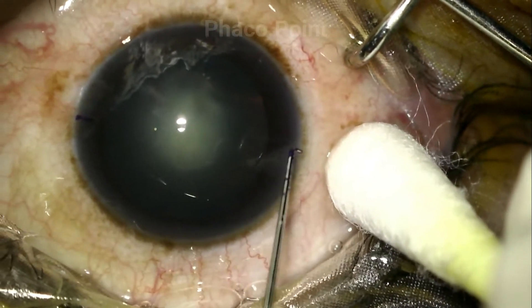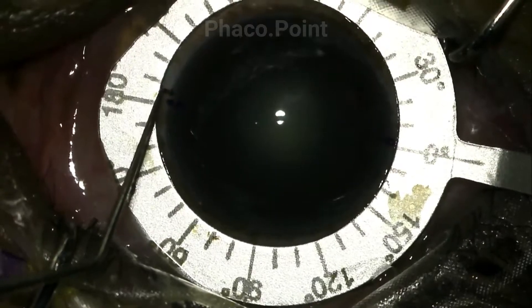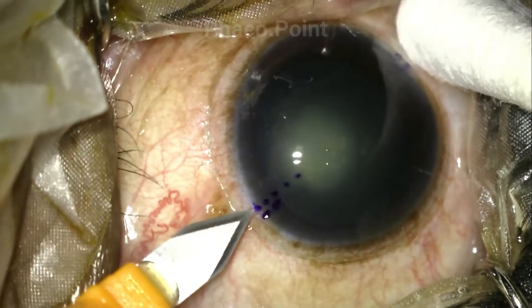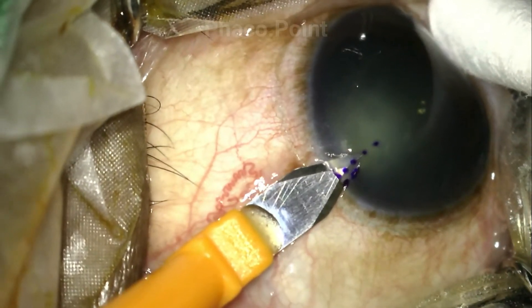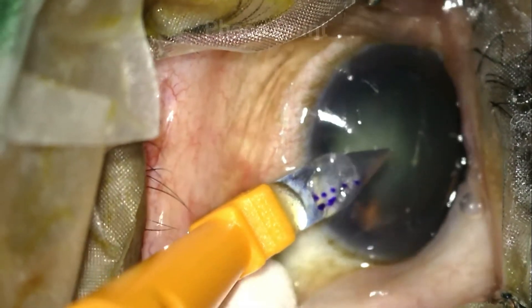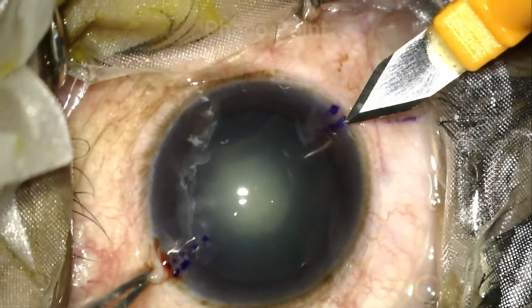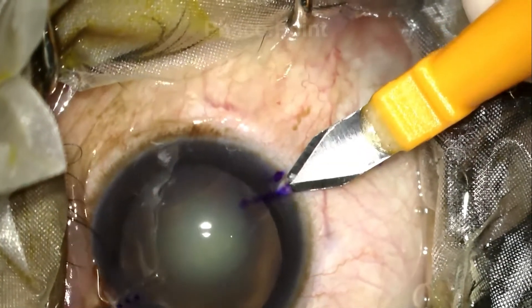This patient had an astigmatism of about 1.5 at 175 degrees. After marking the 0-180 with a Mendez axis marker, we have marked and highlighted the steep meridian. Here you can see the 2.8 clear corneal tunnel being created. It's important to try and bisect the steep axis such that the incision is equal on either side of the steep meridian. An opposing clear corneal incision is also being created.